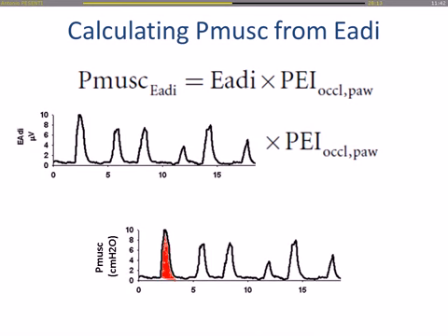Now, if I have a patient and I measure the electromyographic signal, I can follow breath by breath how many microvolts the patient is putting into his diaphragm. And if I know in this patient, in Giuseppe, 1 microvolt is 3 centimeters of water, so when I see 10 microvolts, I know he's making minus 30 centimeters of water in his chest. And so he will have minus 30 in his pleura.